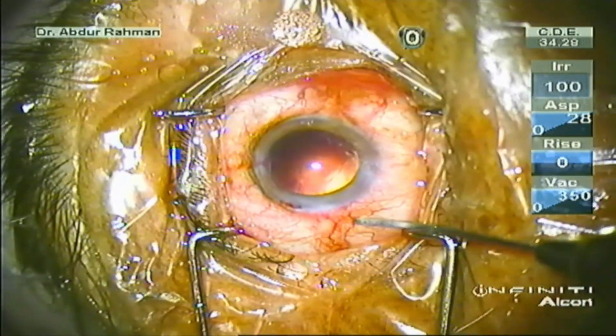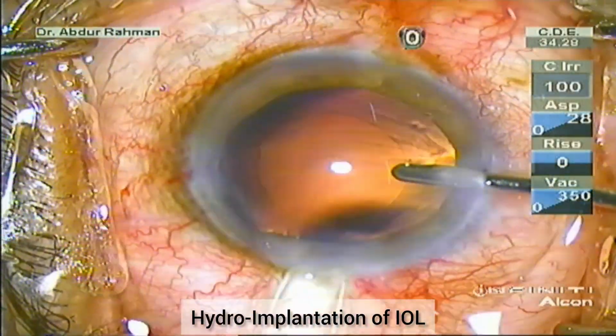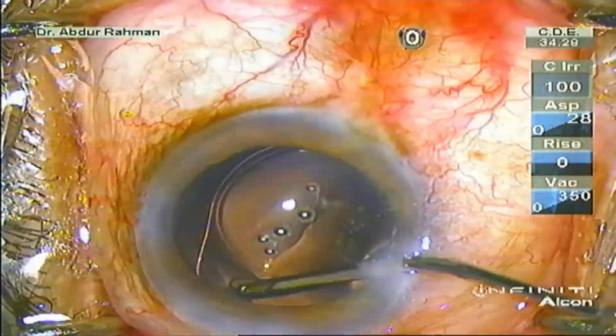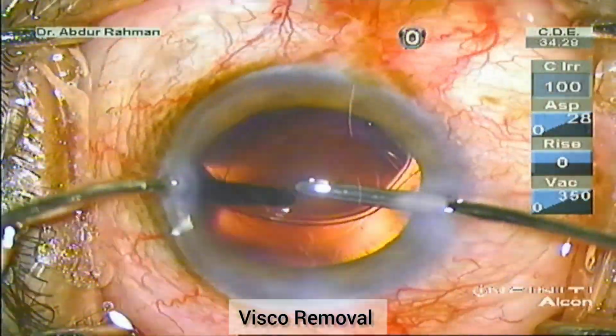Now I am performing hydroimplantation of the IOL into the PC bag. Dial the trailing haptic into the PC bag. Now remove the visco from in front and behind the IOL.